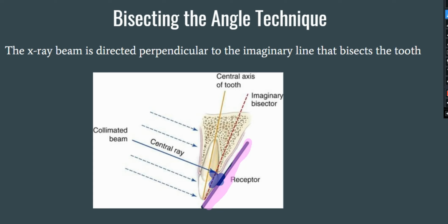So that first triangle that we see will be right here. What's one side of it? And then the other side of it follows along there. The next step was to visualize the imaginary bisector. This line right here is that imaginary bisector. You can see it is cutting this one big triangle in half to form two equal triangles.